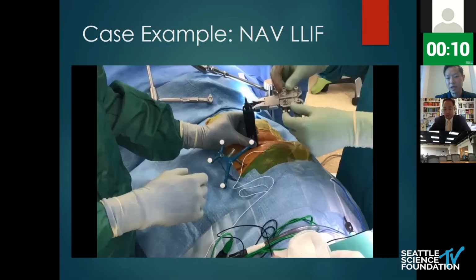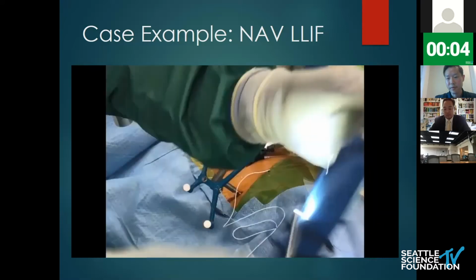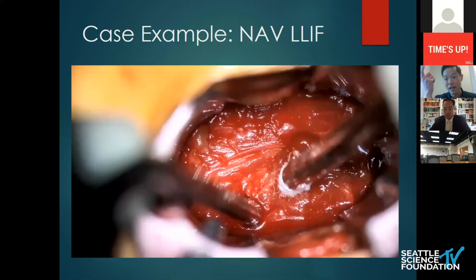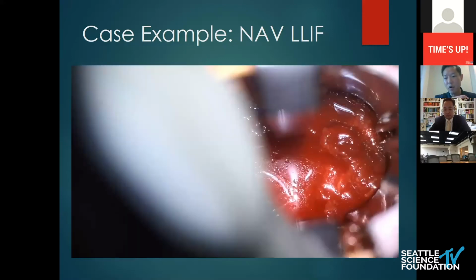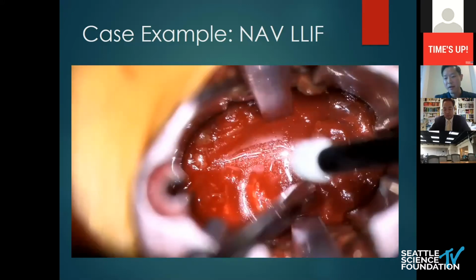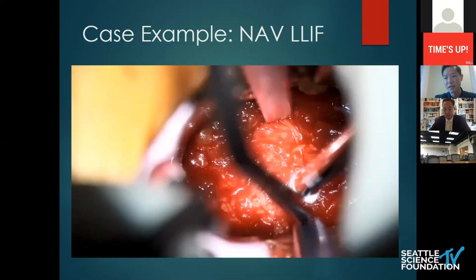The retractor goes in, and the dilator serves as an anchor. It's centered down the disc space, so you know exactly where you are. Now you can use a navigated pointer at any stage to determine your trajectory or where you are within the disc space. But it was centered there nicely. You saw that little hole where the dilator was. We know that's the center of the disc space, and that's the annulus of the disc now.